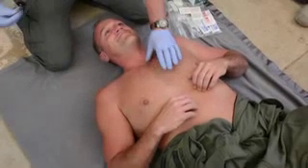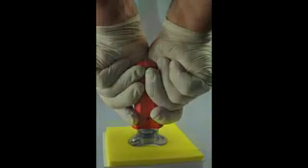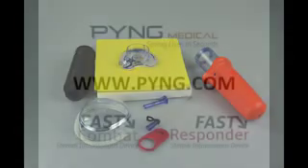The volunteer patient is a 32-year-old male in excellent physical condition. The provider deploying the Fast Responder Sternal Interosseous device is a nationally registered paramedic, and this is his first deployment of the Fast device. The responder received training prior to this insertion, which amounted to a 10-minute lecture and demonstration by a PhD medical researcher using the Fast Trainer device and SimStern material.